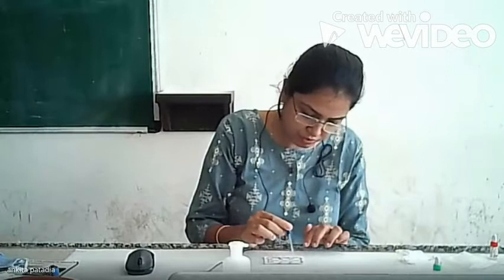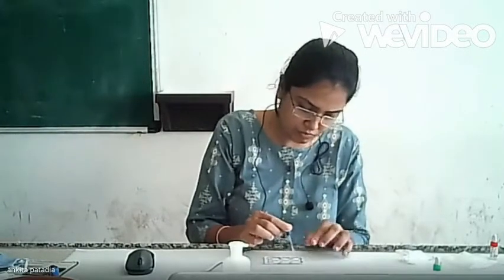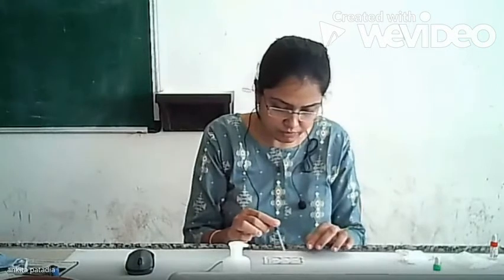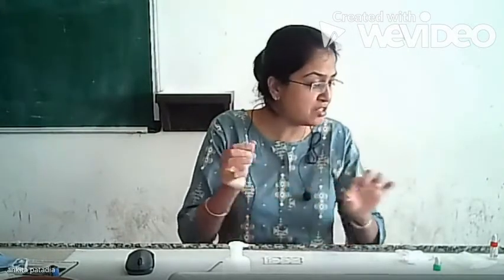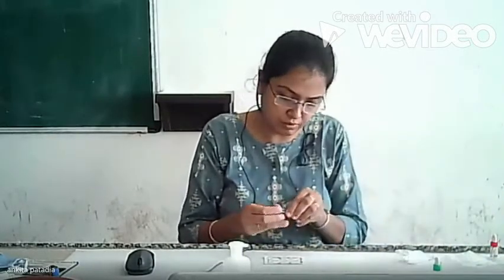Now for mixing also, one drop from 1:1 to 1:2. For each dilution, you have to take new dispenser.